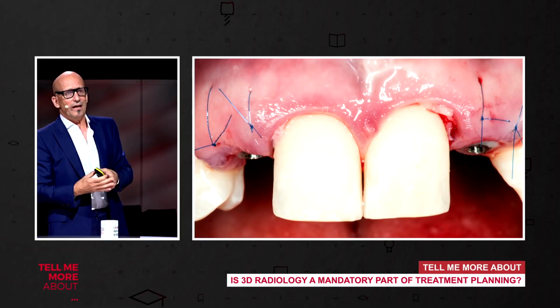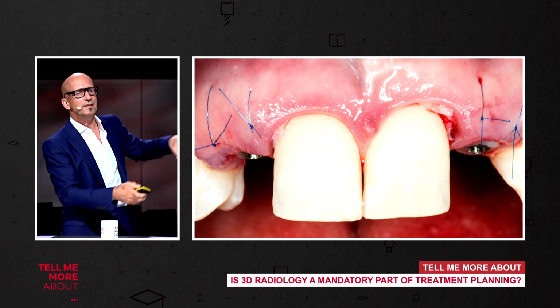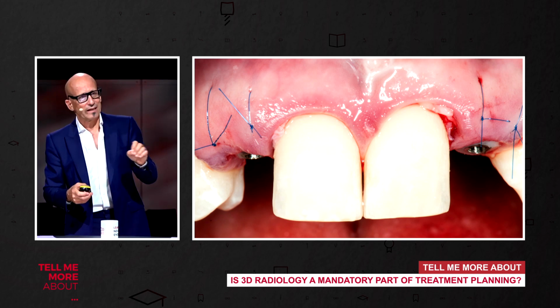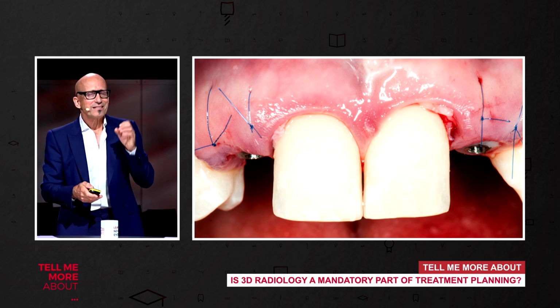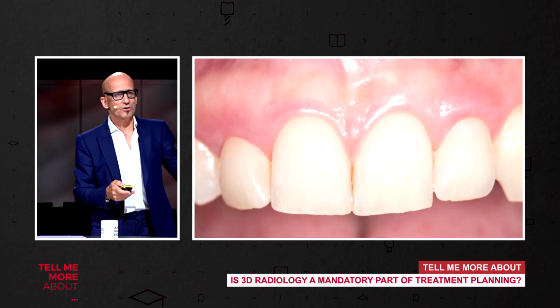So now you let Mother Nature heal, and you're finished. You can send the data to the lab technician, he can make the crown, and in the second session, you are going to place the final crown. And this is, in my opinion, a big move in the direction we should go on.